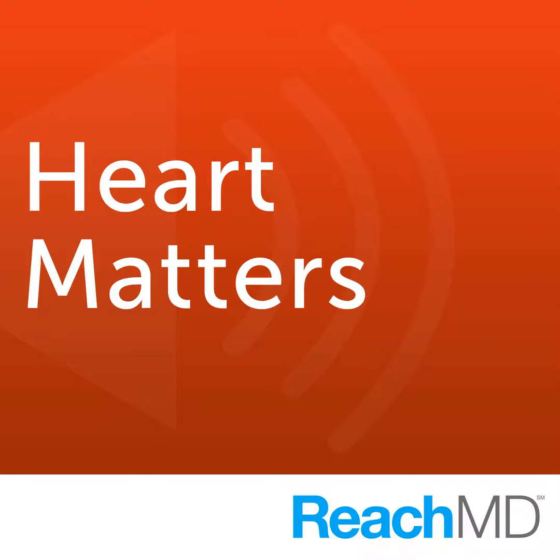In practice, you don't necessarily get as clear a picture if you're focusing on one than if you're focusing on the other. And so I think that some of my radiologist colleagues have been thinking that this is, although in theory a great thing, in practice, if you're really wanting to do a triple rule out, you have to do the scan in a different way, and you may not get as clear information about all the beds that way.